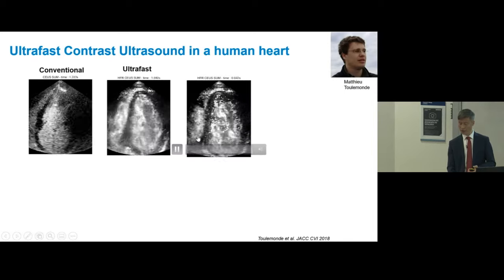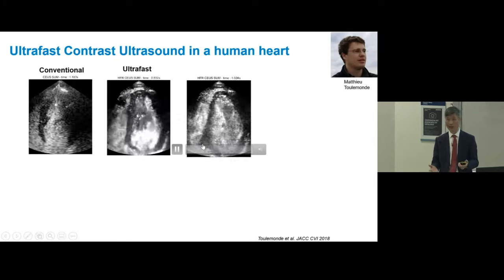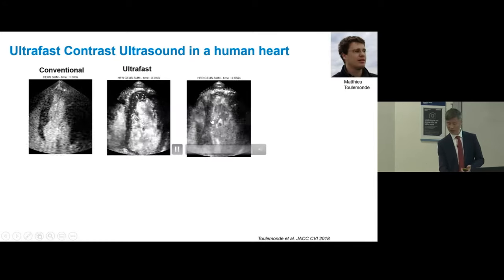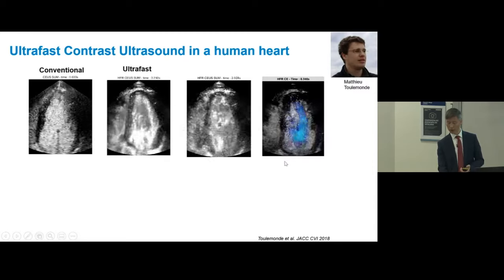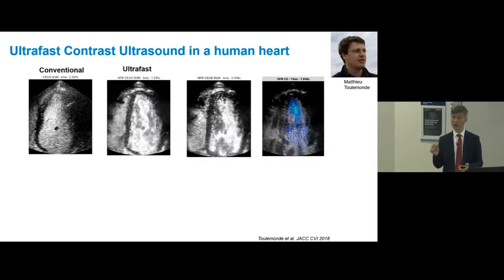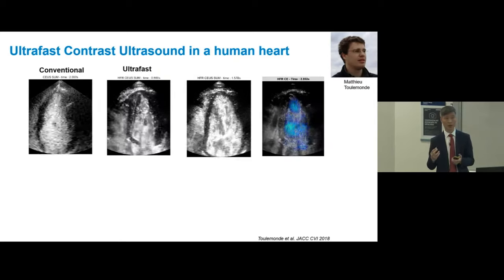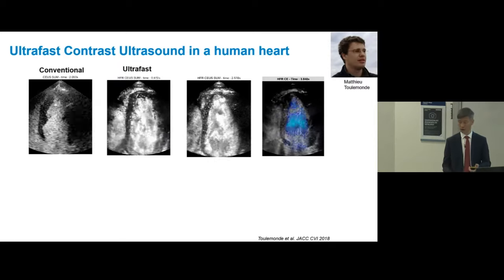This is the slow play of this movie. Because we're acquiring fast, we can actually slow down the motion. And also inside the chamber, you can do so-called ultrasound imaging velocimetry to track the flow and quantify it. Actually, there's a study showing that the pattern of this flow in the heart is related to the cardiac function. So this could be a potential diagnostic tool.